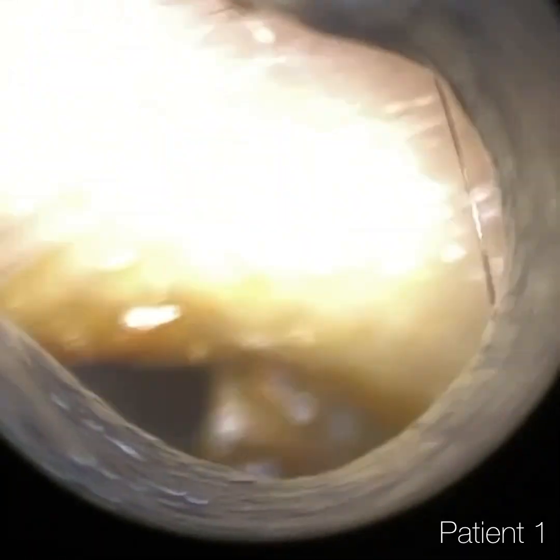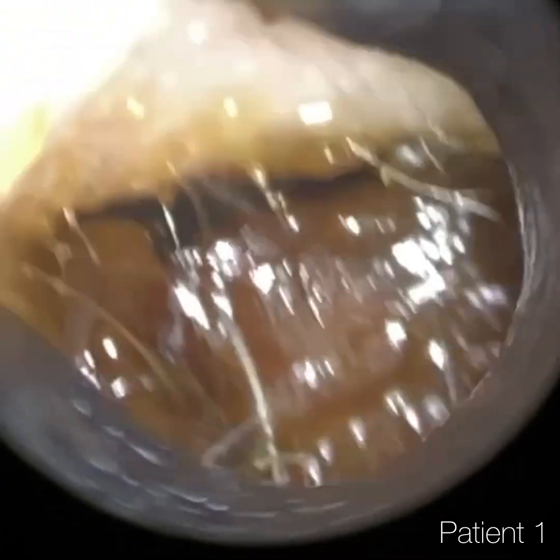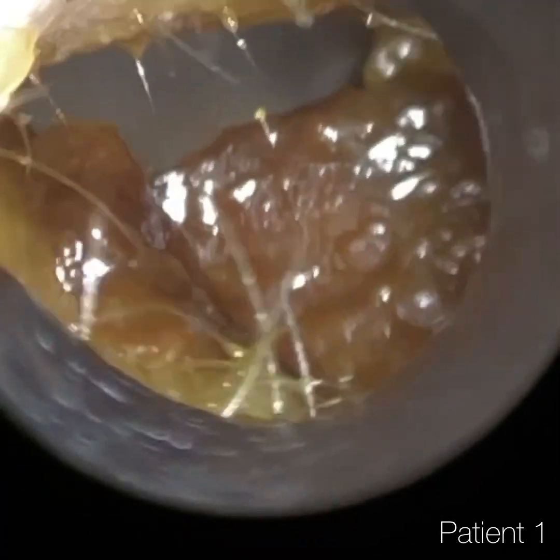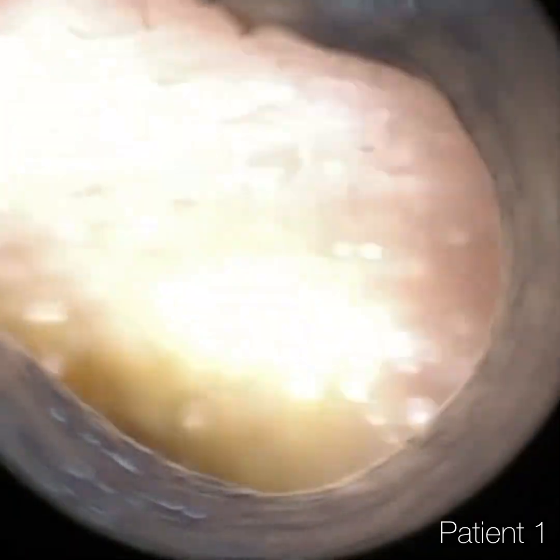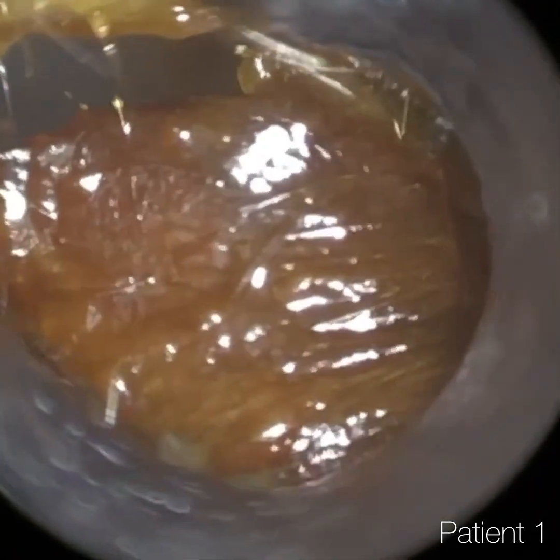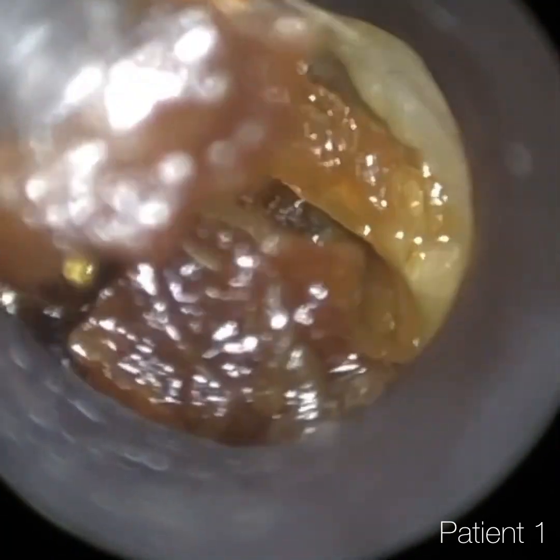And we're just going to move on to their right ear. So in this procedure, I'm using the 4.25 millimetre speculae. I suspect this is going to be the most commonly used speculae, but we have got a smaller one — a 3.5 mm — and a couple of larger ones, a 5 mm and a 5.75 mm.